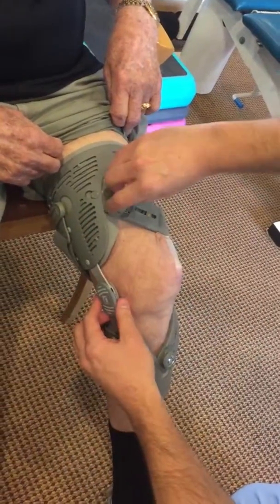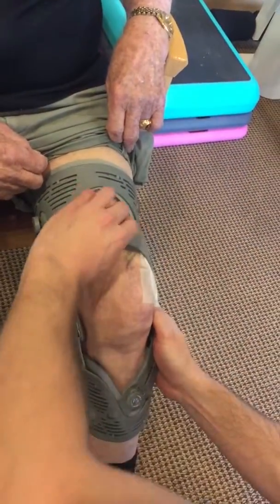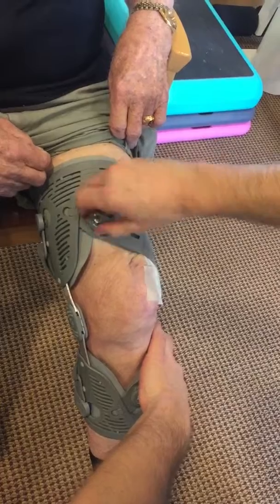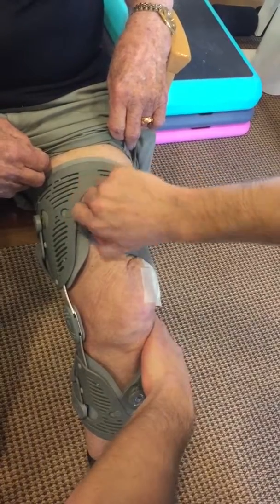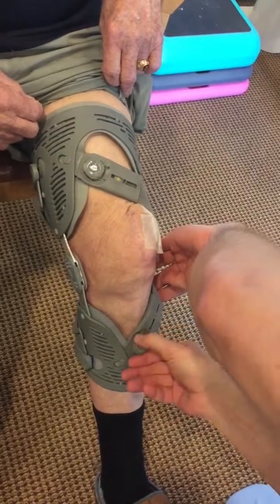The last step will be to tighten the brace, just by twisting to the right with the tabs. I do like to hold the knee as straight as possible when doing that for better correction, and then I will tighten the bottom one as well. The two quick dials.